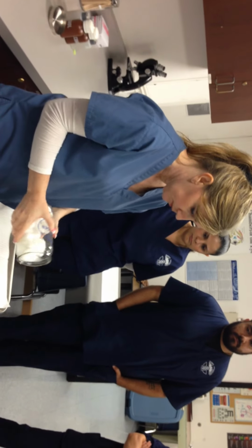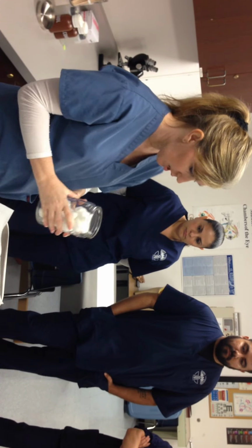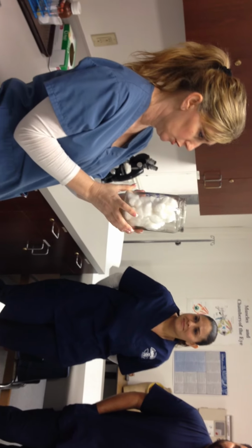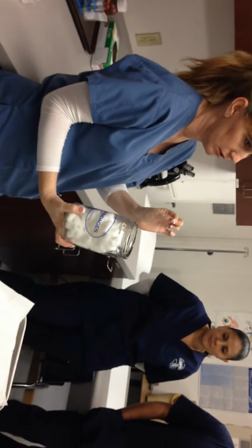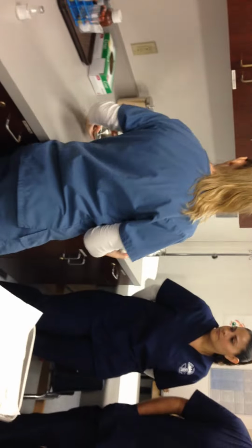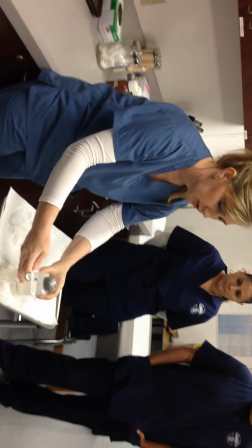And please, when you're filling this up, in the evening or halfway at lunchtime or whatever, don't pack them in there because you want it to look nice and full. When you pack them in there, you're going to wind up dumping 10 out on your tray. Little things that make a difference to make everyone's life easier, okay? So put them in here and make it full, but don't, right? Simple little things. The other thing I need is an alcohol. So what I'm going to do here, this is my, see my clean area? Clean, okay? Here, here, okay?